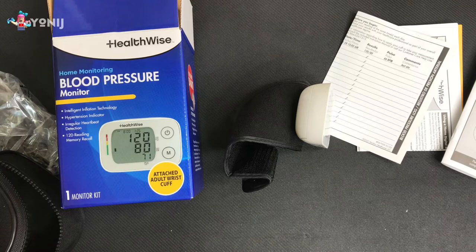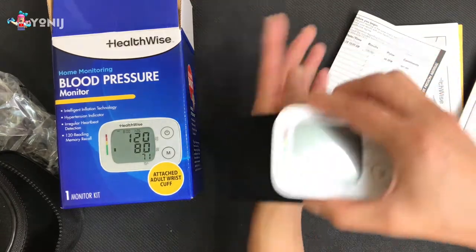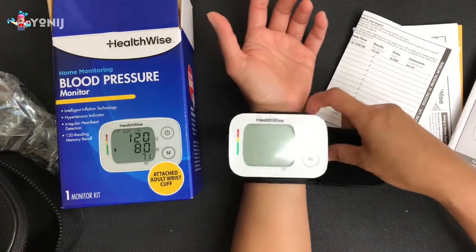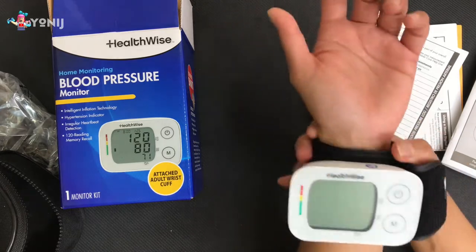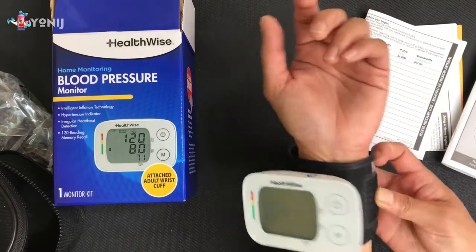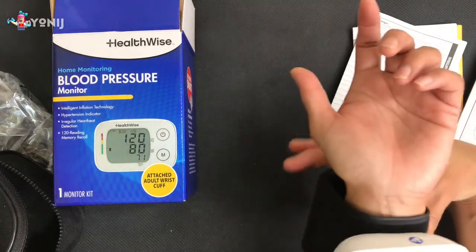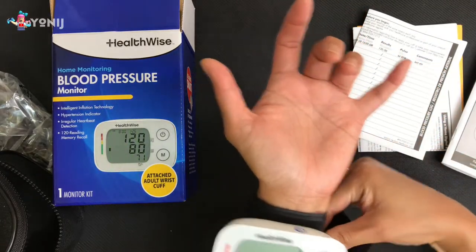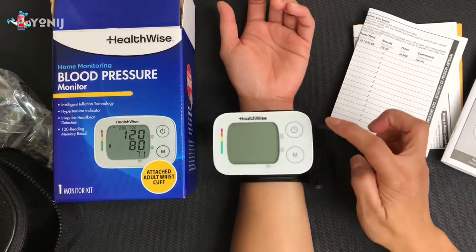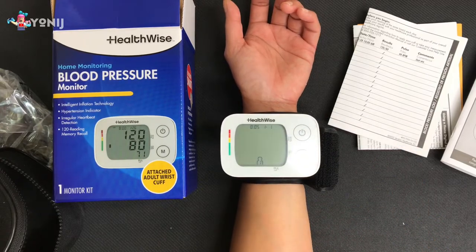Okay, I'm going to try to relax as the manual says. Now I'm gonna put it right here, relax, and put it there. Alright — still half an inch from the bone. It's not easy measuring it. This is my first time using a wrist cuff. Now I'm going to sit down, relax, and be quiet.